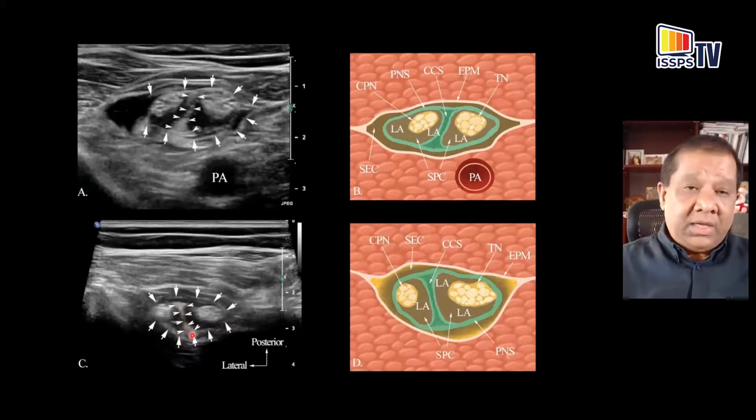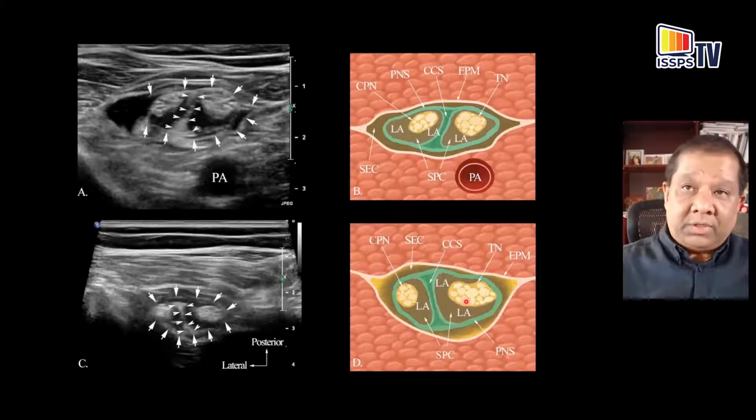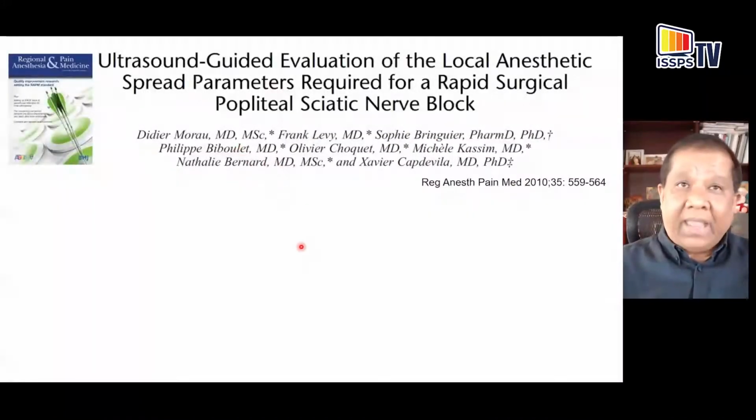And you can see there's a septum-like structure that comes up, it gets organized in the middle, and this forms kind of a septum between the two nerves with the two halos that separate the main trunk of the sciatic nerve, both at and below.